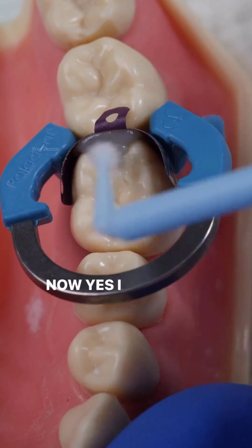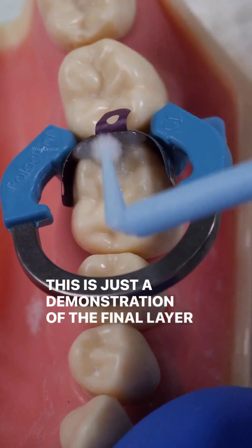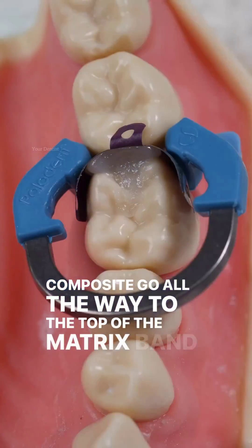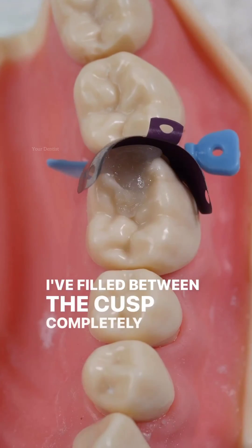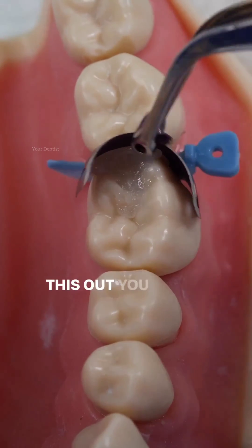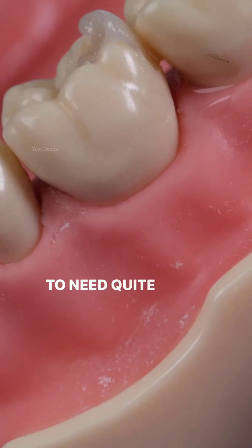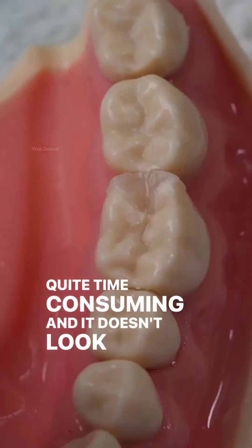Now, I know that I'm not doing increments — this is just a demonstration of the final layer. You can see here I filled the cavity up and I've had composite resin go all the way to the top of the matrix band, filled between the cusps completely. As soon as I take this out you will see that it is way too high and it's going to need quite a bit of adjustment with the burr, which is quite time consuming and doesn't look good.